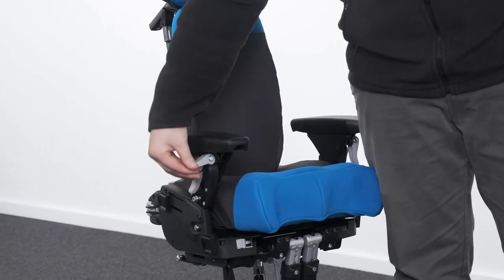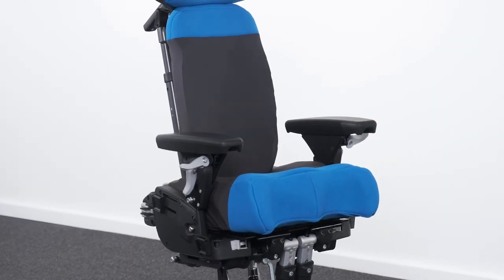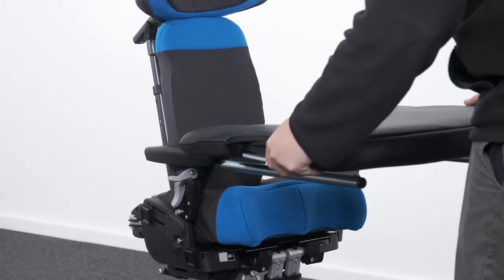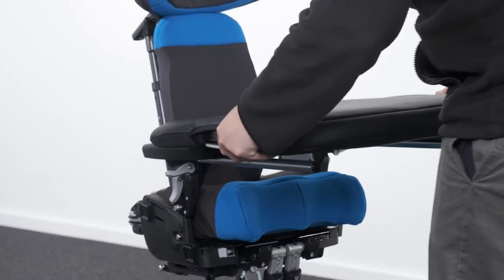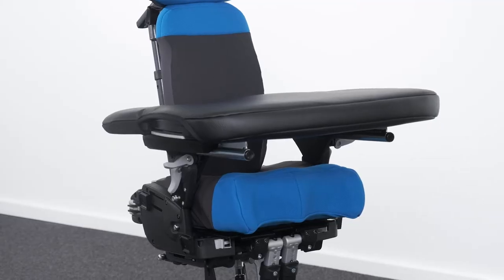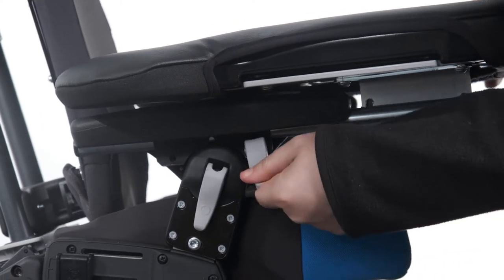Attaching the tray. Before inserting the tray, ensure that the cam lever, located at the front of each armrest, is open. To attach the tray, insert the tray tubes through the centre of the armrest, ensuring that the tray tube protrudes out the other side of the receiver. Once the tray is in the desired position, the cam lever should be tightened securely.